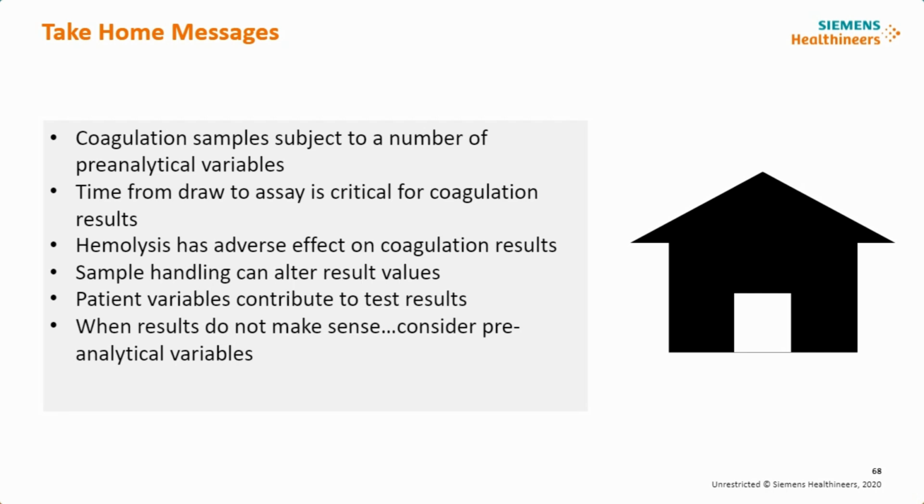And of course, I've also been on the receiving end of when an irate physician calls and complains about specific tests, that the tests don't make sense. Having that open line of communication, being able to discuss the patient, looking at the results, looking at the patient history, most oftentimes will shed light that there was a pre-analytical variable associated. And the old complaint that it's always the lab's fault is not necessarily true.